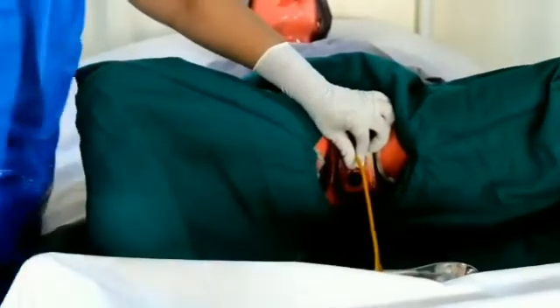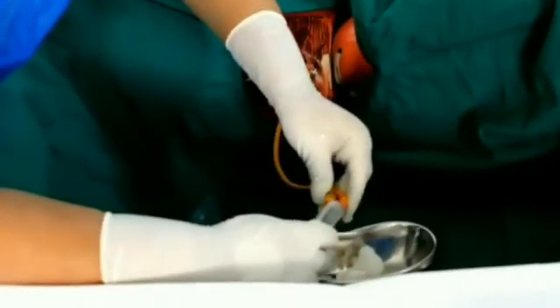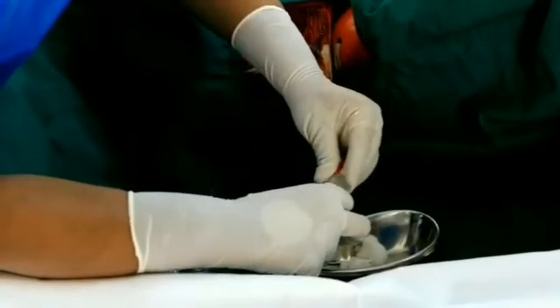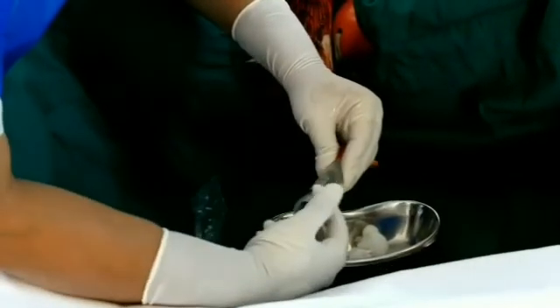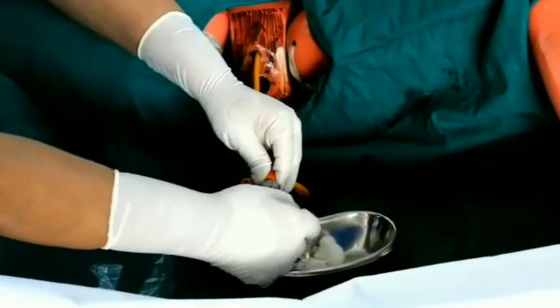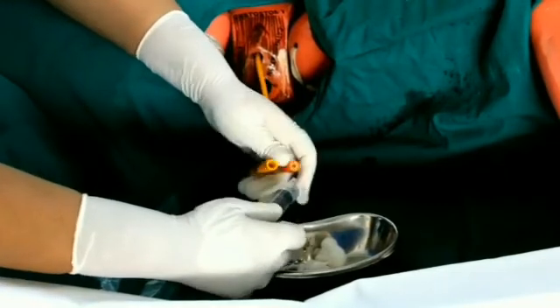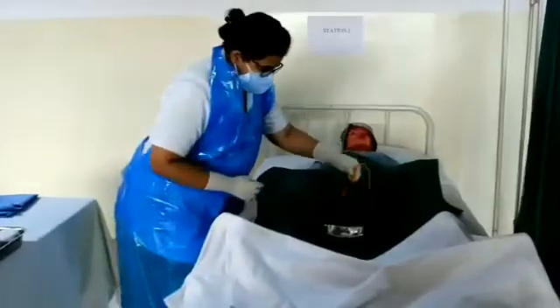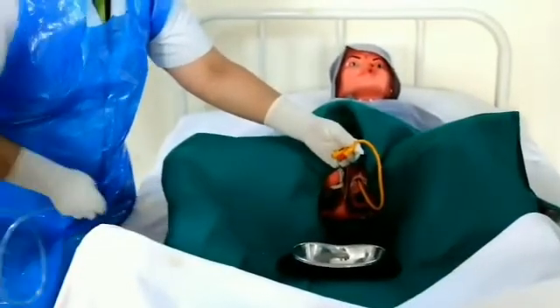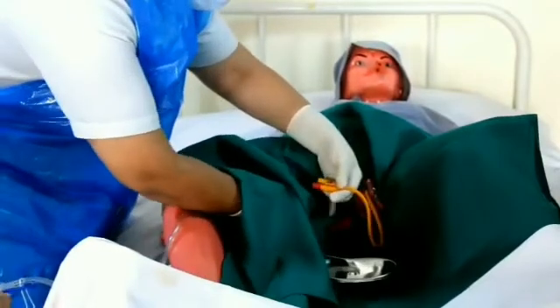Now, we have to inflate the balloon with 10 ml of sterile water. Insert the syringe in the balloon port of the catheter. Push the 10 ml of sterile water inside to inflate the balloon. After that, gently pull the catheter back until you feel the resistance. Now, we have to attach the catheter to urobag or drainage system.